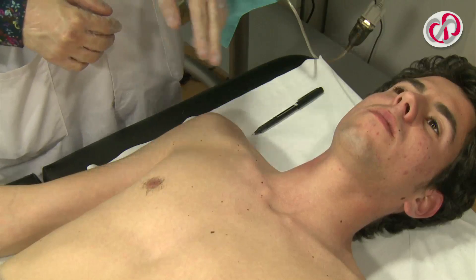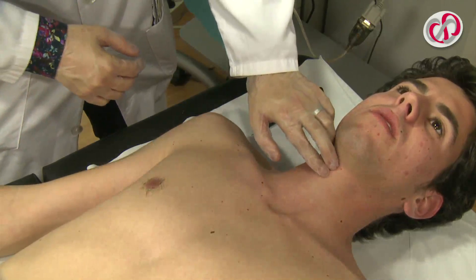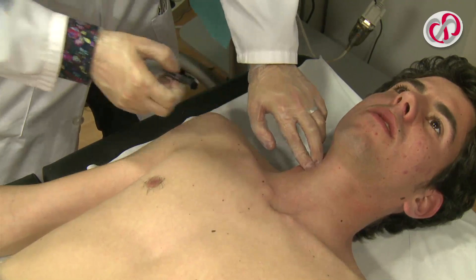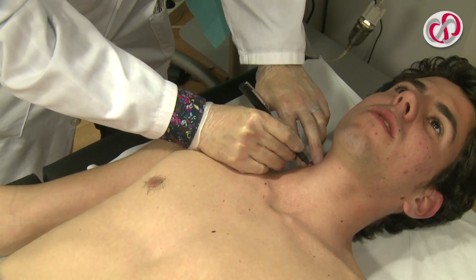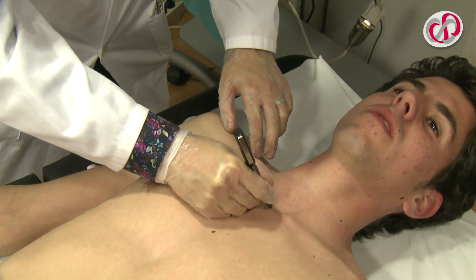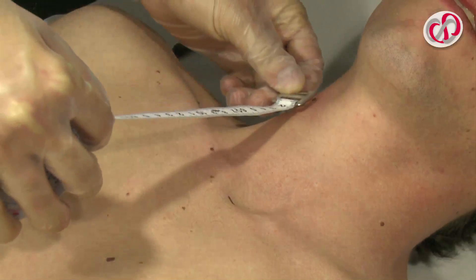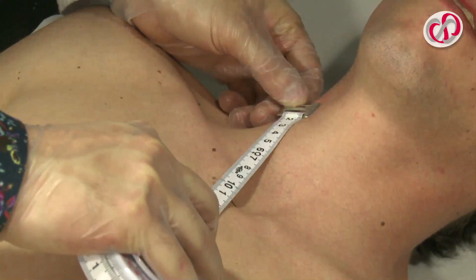The proximal distance is measured. To do this, a measurement is taken using the index and middle fingers from the glottis until the carotid pulse is found. The site where the pulse is strongest is marked. We look for the proximal part of the sternal manubrium, mark it out, and proceed to measure the proximal distance.